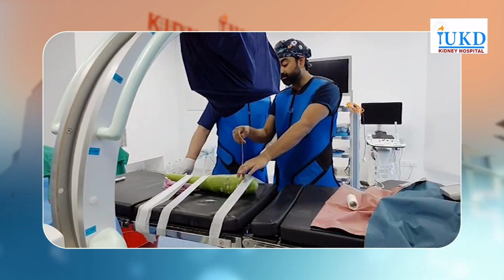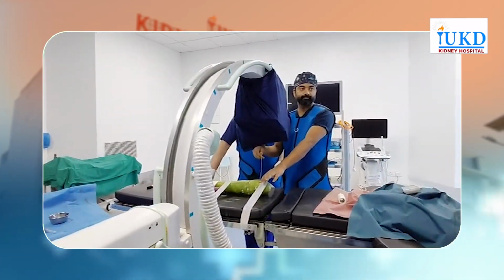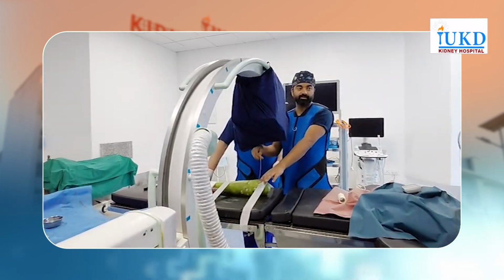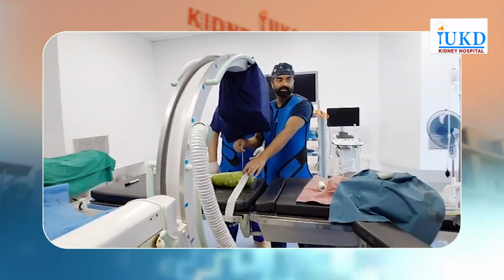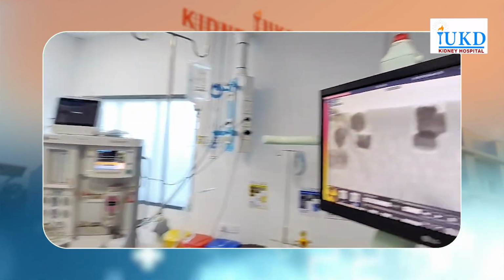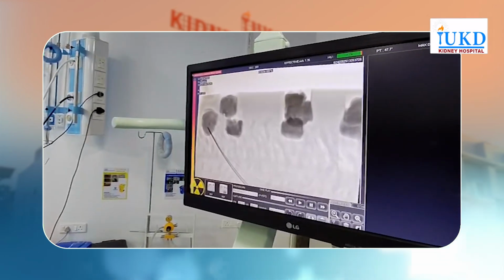See how this will travel to here. This point will travel to here. You know? Okay. So now my finger is here and see my tip is sure. See here. See the difference here. It's around 5 centimeters. Simple.